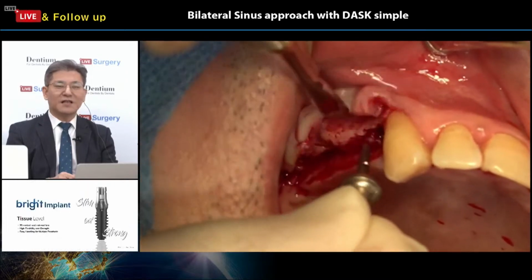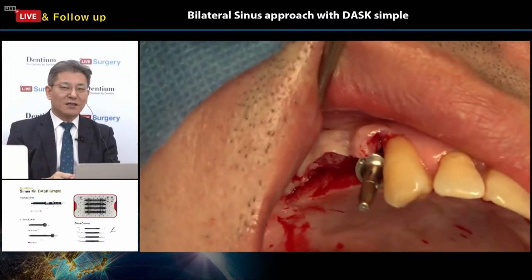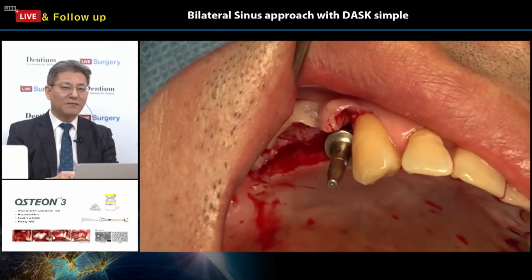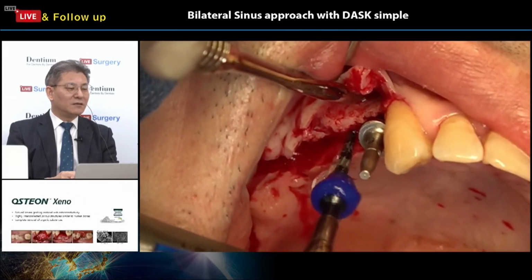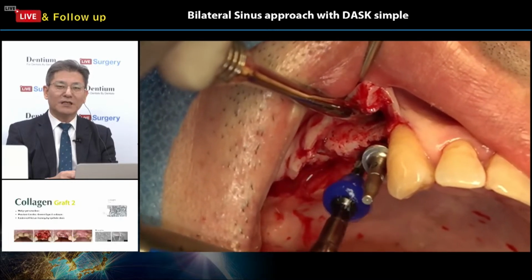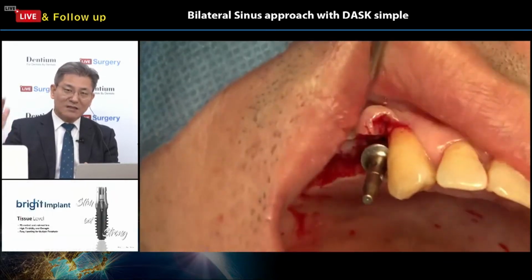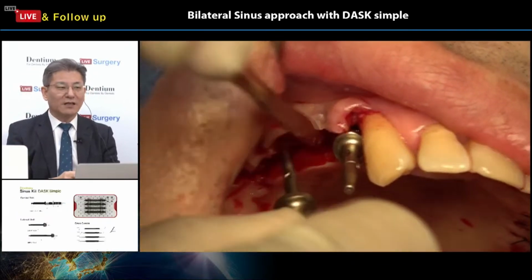Yeah, he is considering the root of the canine axis. According to this axis of the canine, he is considering the path of the number 14 implant fixture drilling. Very important factor when you have a number 14 and 24, the first premolar insertion, because the canine ordinarily has a little bit of distal curvature, right? So we have to consider the distal curvature of the root of the canine.